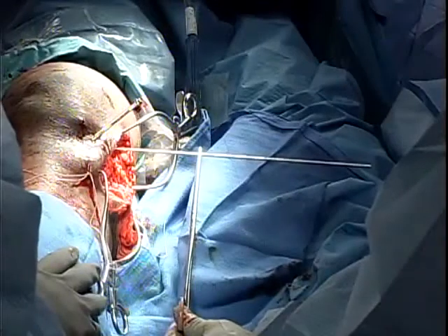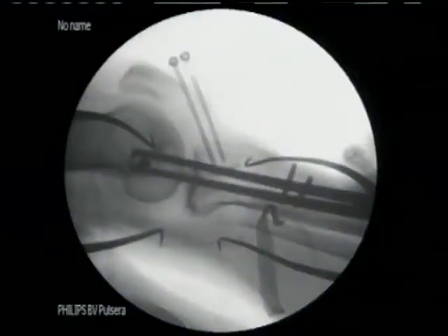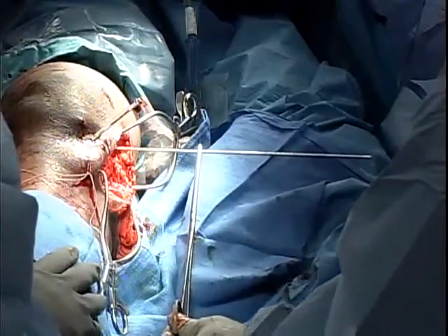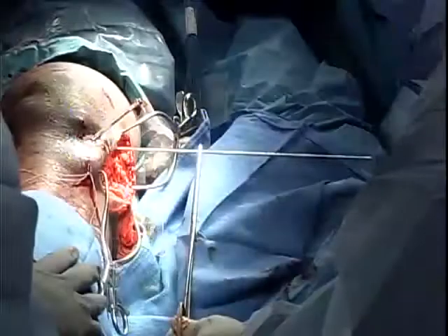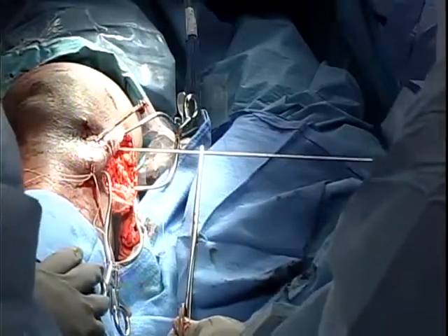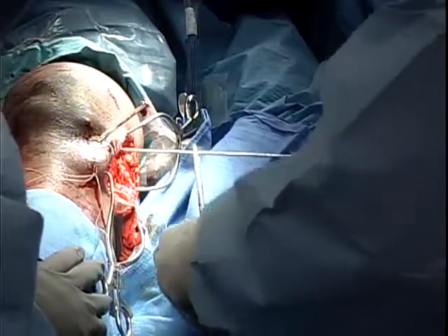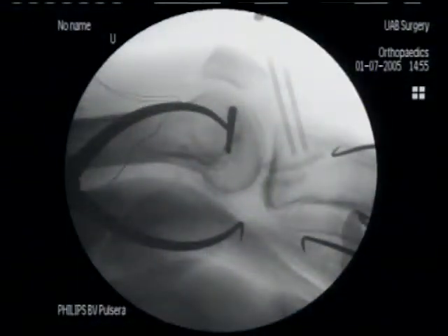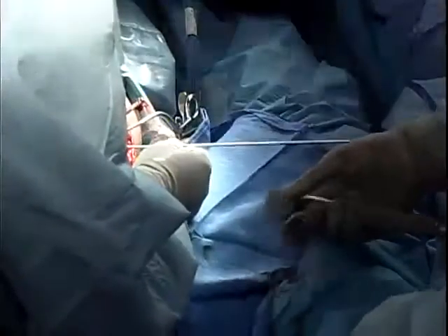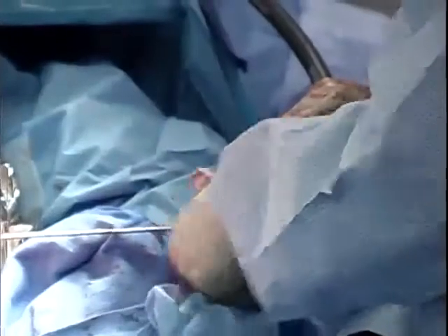Continue making fine adjustments until the wire looks almost like a dot. Once satisfied with that position, remove the coker and recheck. Obtain a perfect lateral, and the wire should look like a dot. Confirm the wire looks like a dot on the good lateral view before proceeding to drill.